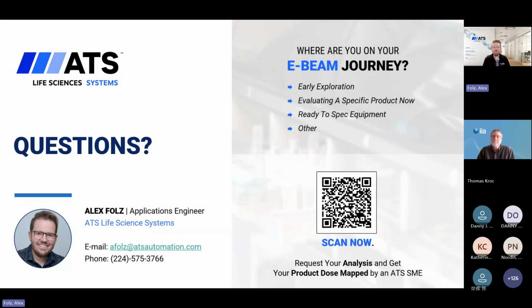Is what dose uniformity ratio do we get back? And typically we're in that couple inch range, somewhere around there, but don't want to put an exact number to it because it's so material dependent. That's really more what we'd like to do is have your product dose mapped. We'll let you know the dose uniformity, and that will dictate, can my part be 1 inch tall? Can it be 6 inches tall? So on and so forth. So again, that's just showing the importance of dose mapping.